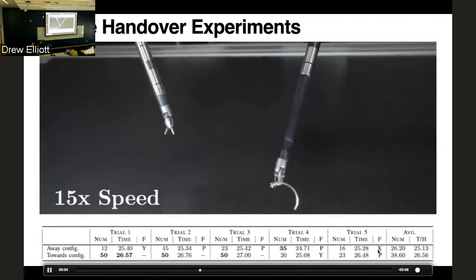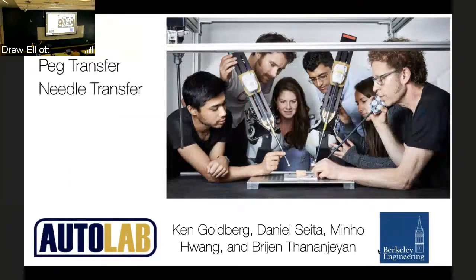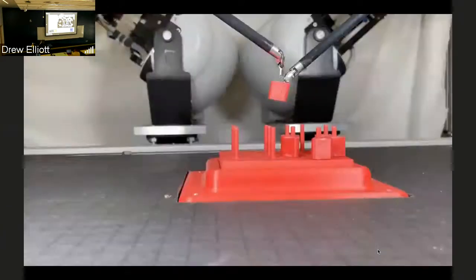We're really pleased with this, and this is sped up 15 times, of course, so there's a lot more to do, but it's promising that we're able to detect the needle pose, resolve it, and then actually servo the two end effectors to hand it over in that way. Okay, so that's what I have, and happy to take questions.